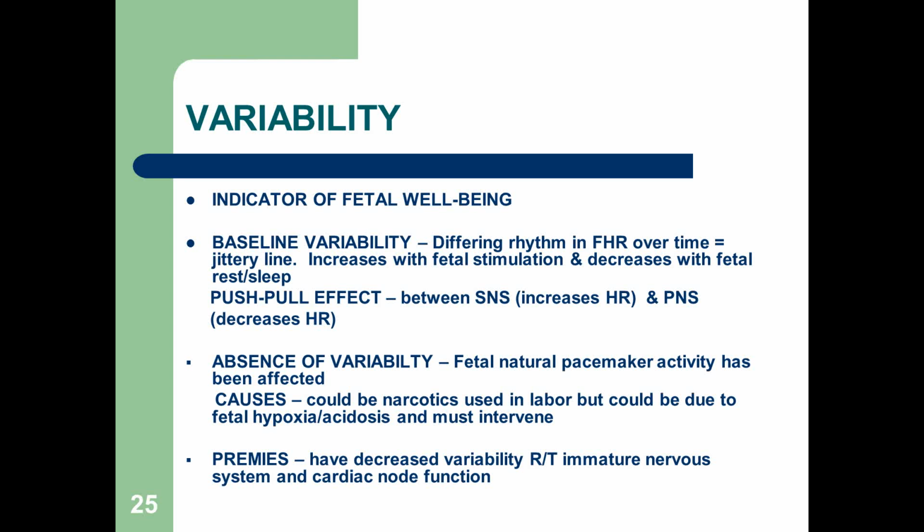Premature babies, however, they're going to have decreased variability because their nervous systems have not developed fully, so they may not have a lot of variability. And so if you know you're monitoring a premature baby, then you know that you're not going to have a lot of variation there, okay?